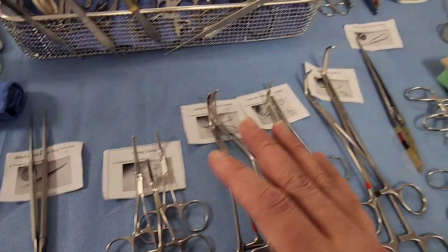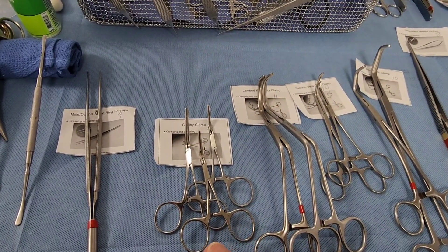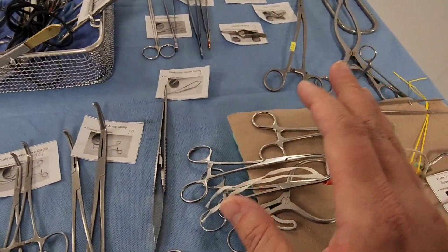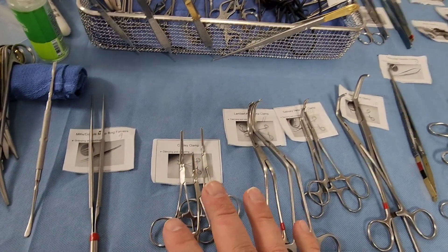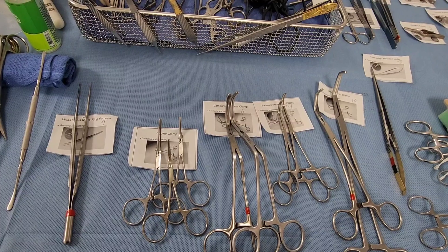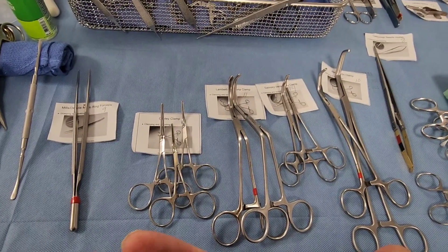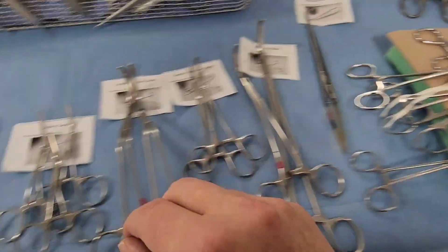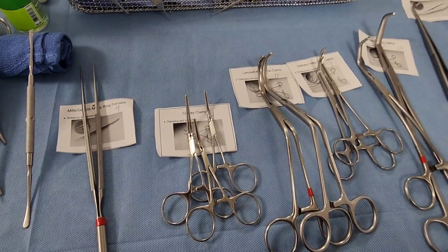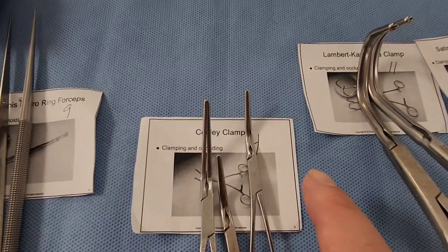A common theme in vascular instruments is clamping and occluding — we want to stop bleeding. The most common question is: why are they angled in different directions and why are some bigger? It's just like anatomy — some vessels are smaller and some are harder to access, so there's a clamp for each purpose. We're going to go over the most common ones.